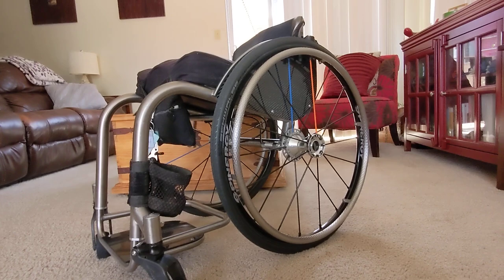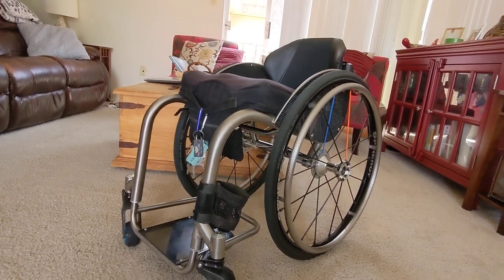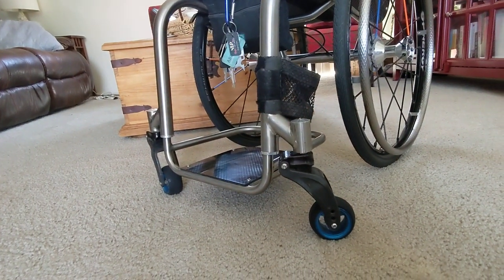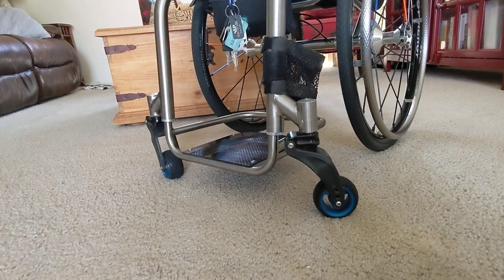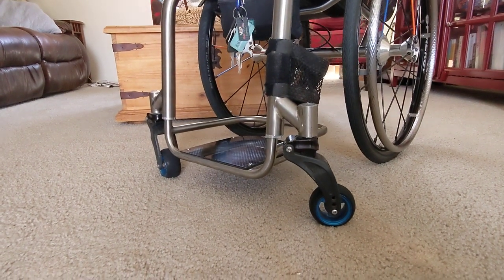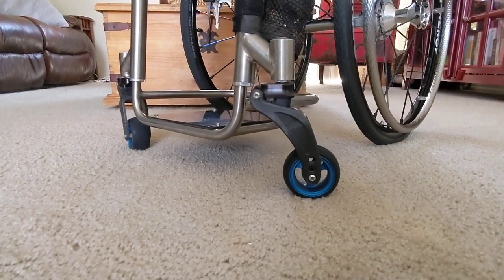On this chair I've got carbon fiber side guards with a titanium brace over the top to keep them from flexing. Starting from the front, it also has a carbon fiber foot plate, and I added an extra tube around it to keep my feet from sliding off the back of the foot plate.